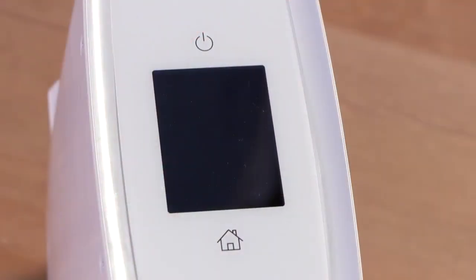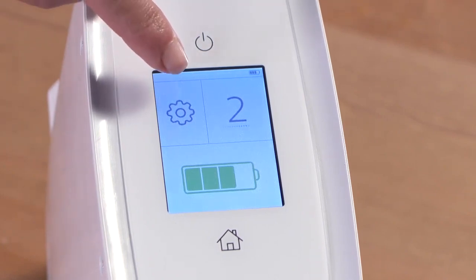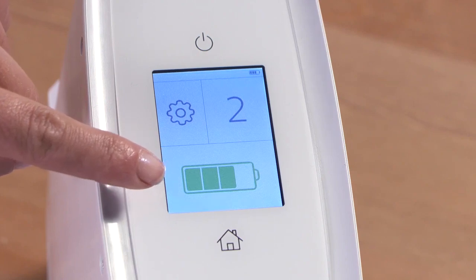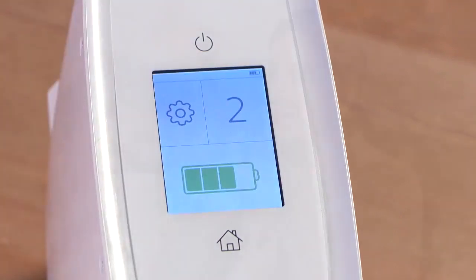Before using the cannula with SimplyGo Mini, you touch the black screen or press the power button to view your oxygen settings and check your battery capacity. This screen will automatically shut off after 5 seconds. To make it reappear, simply press the home button or touch the black screen.